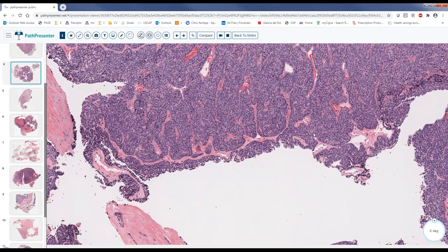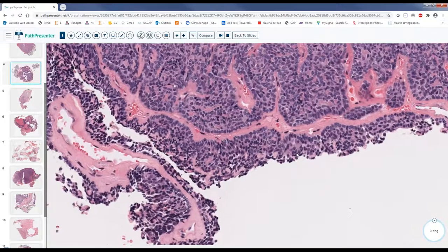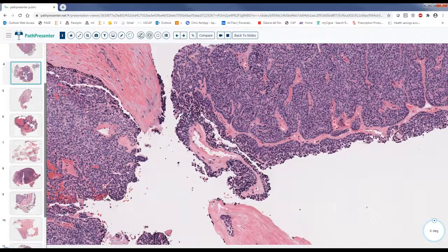Are you guys comfortable? It is not basal cell adenocarcinoma based on what I told you right now? Yes, so you can tell me it is a basaloid neoplasm based on what I told you. Now it is your homework to go and check the entire capsule.